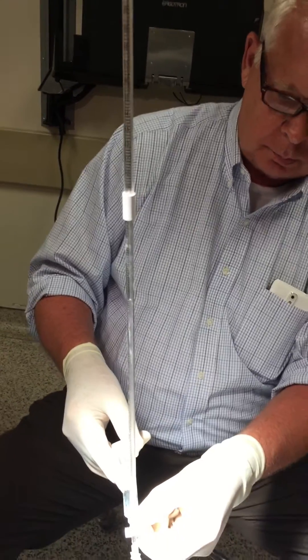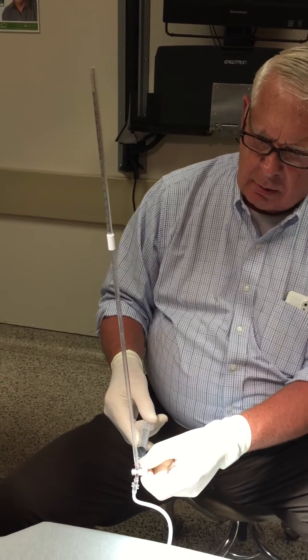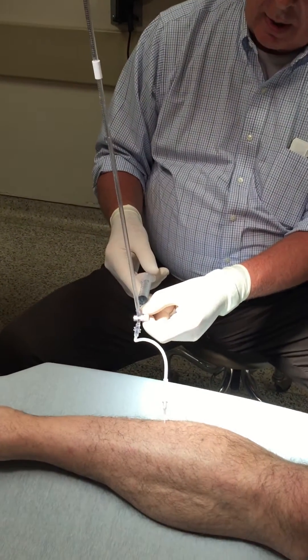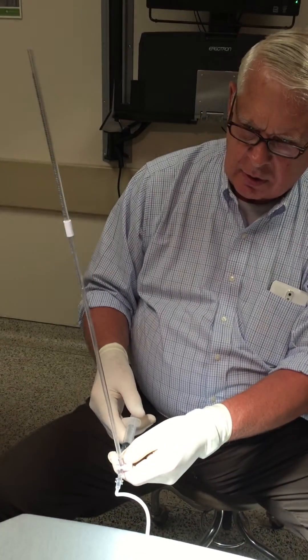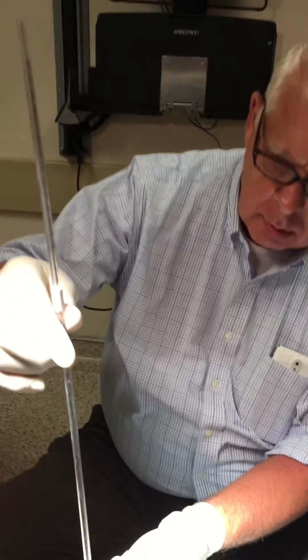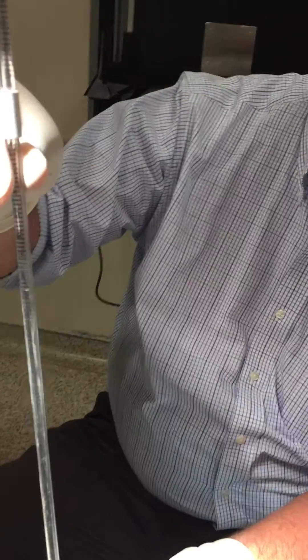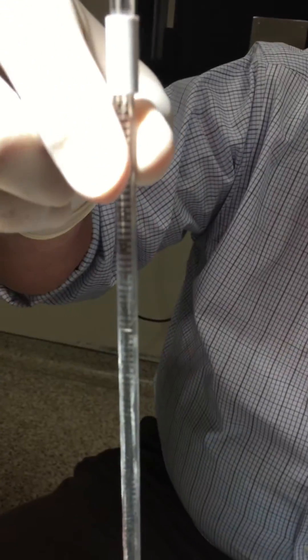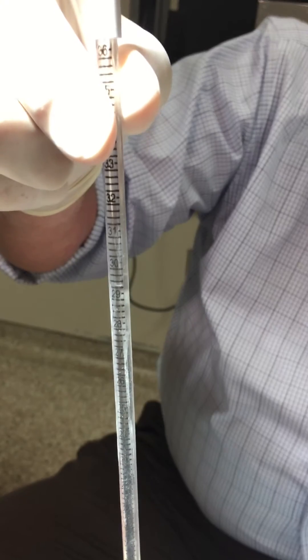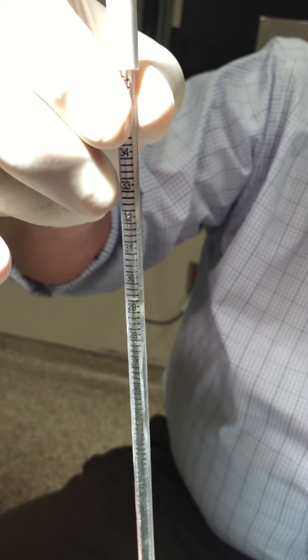Does it matter if you're at level with my leg? Yes, we should be at the level of your leg right here. And so we're going to be right in that area right there. Let's see what this measures here. Can you see the number on that? Looks like 29. So we're good.